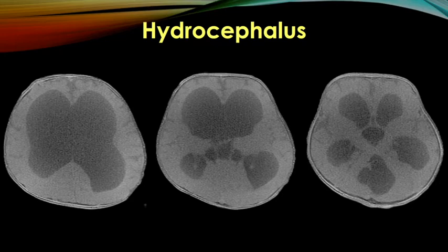And here I'm just showing that there are other ways to accomplish this. This is a patient with post-hemorrhagic hydrocephalus who presented with increasing macrocephaly, and there was some concern, is there anything else going on here? So you do have a pretty nice screen of the parenchyma, certainly no worse than CT. You can also see that the sutures, again, are a little bit patulous, but nothing is synostotic.